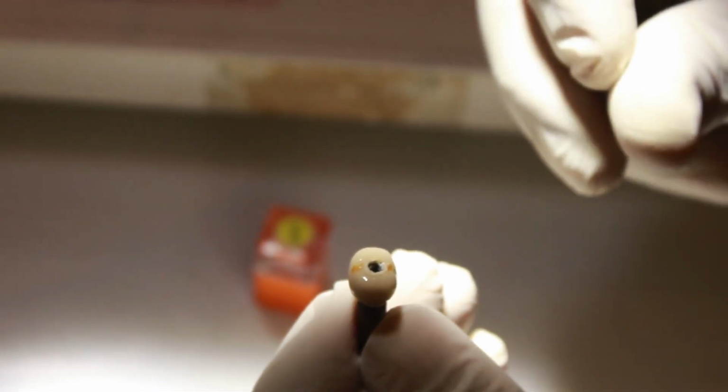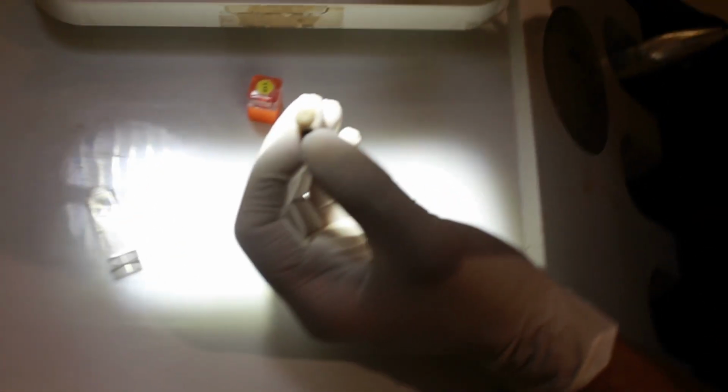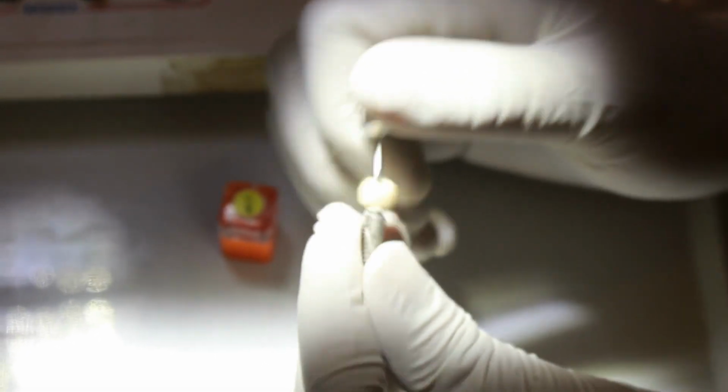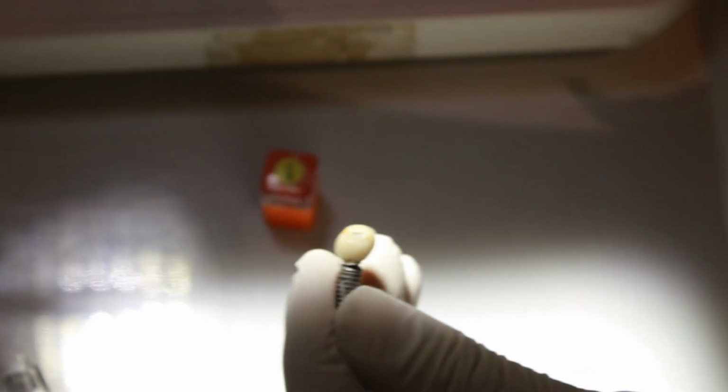This is a very simple procedure, but if it is delayed, if you have not replaced the tooth within adequate or proper time, then complications come, wherein we may have to do certain other surgical procedures like bone graft, etc., which can increase the complexity and cost of the implant. The procedure is very minor. We even have patients who have reported without taking any major medications after the implants are placed.